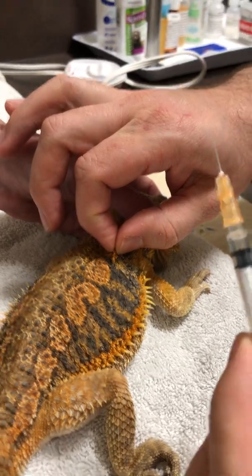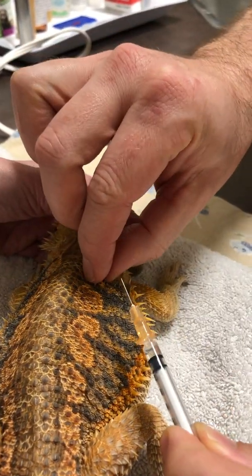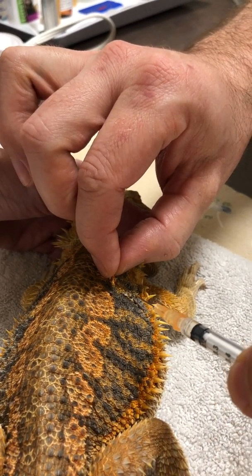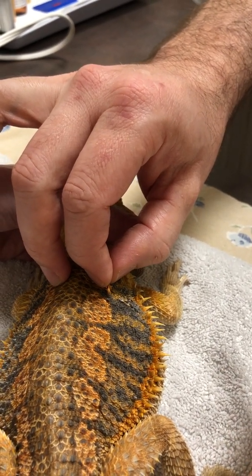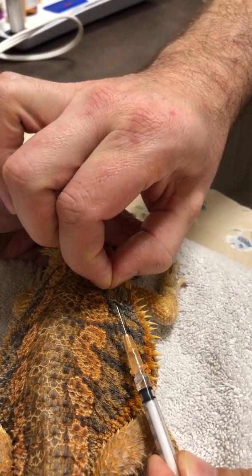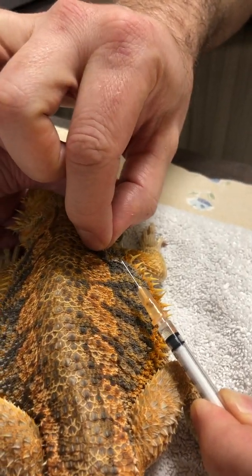When you're giving the injection, probably the most important thing is to keep the needle as close to parallel with the skin surface as possible. You don't want to be angling the needle towards the dragon, because if he decides to jump and bump towards the needle, you could potentially do some damage. Whereas if you're staying in line with the body, it's very unlikely he's going to hurt himself on the needle.